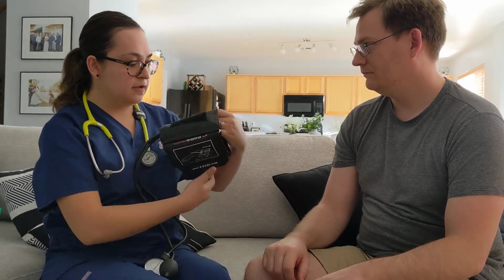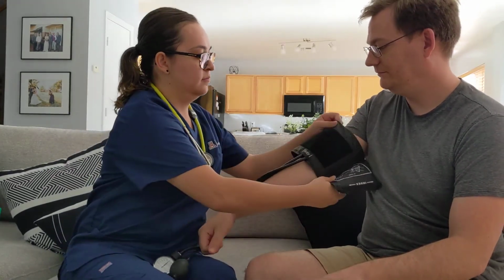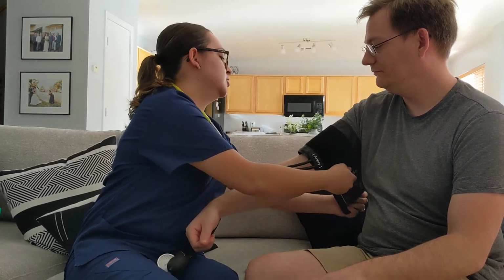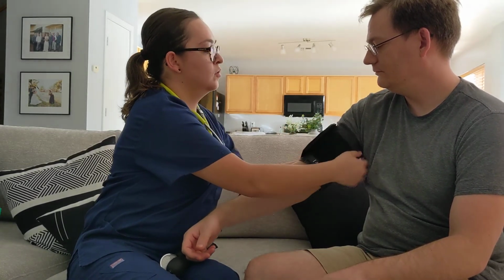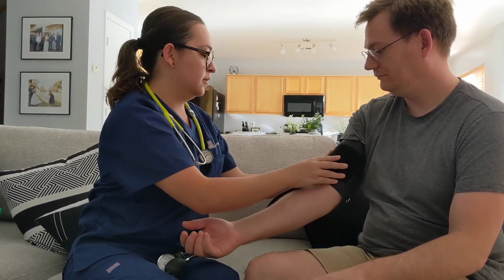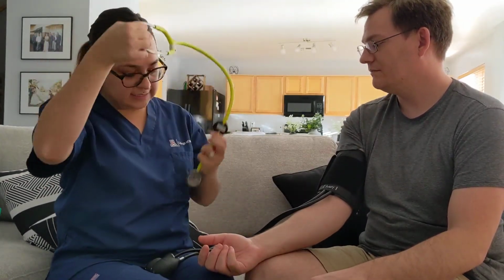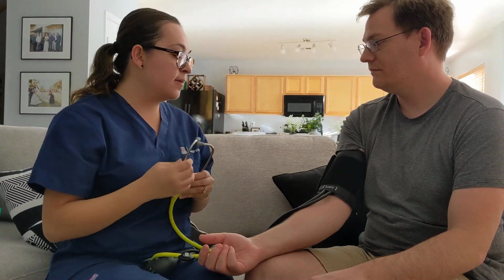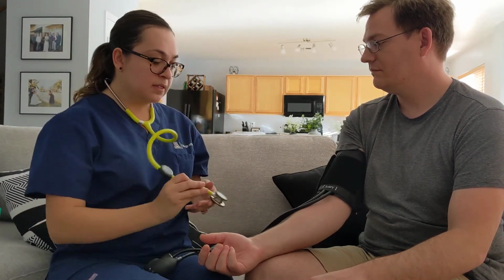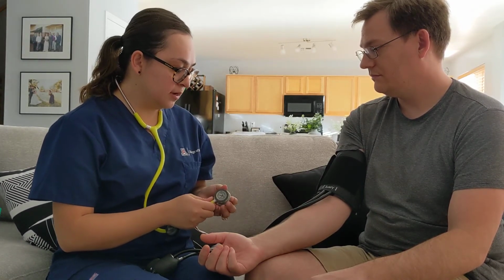Perfect, so I'm just going to place the cuff now. And have you had anything to smoke or drink in the last 30 minutes? No. No caffeine? Nope. Okay. And then you want to make sure the clothes is not under the cuff. Perfect. Okay, it's not too tight? Nope. Feels fine. Perfect. And then with my stethoscope, when I place it, I want to make sure my diaphragm is not being covered by the cuff. I want to make sure nothing's rubbing up against it so that I get an accurate reading.